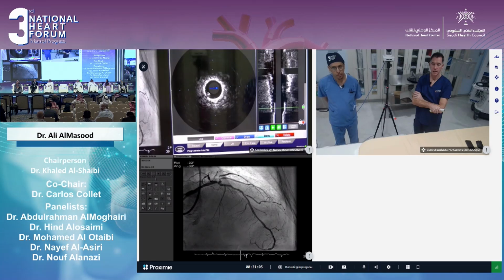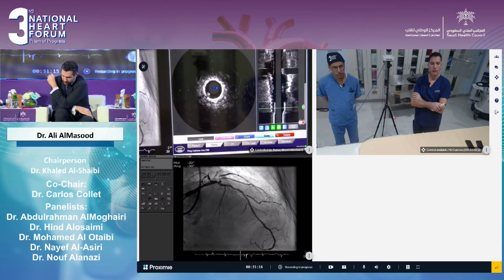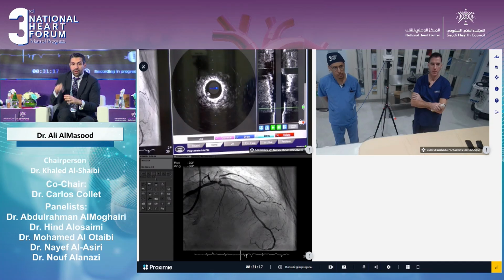Okay, Colm, I think we are. Go ahead, please. I don't know if you can appreciate that. There is a lesion in the trifurcate which is quite tight. But anyway, I'll tell you what we did.